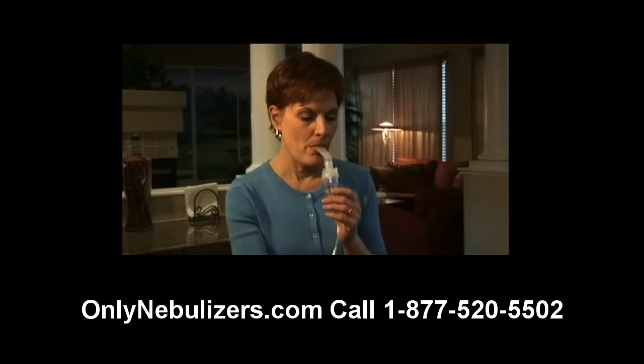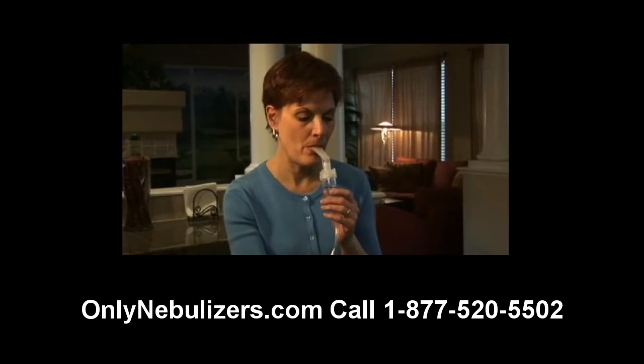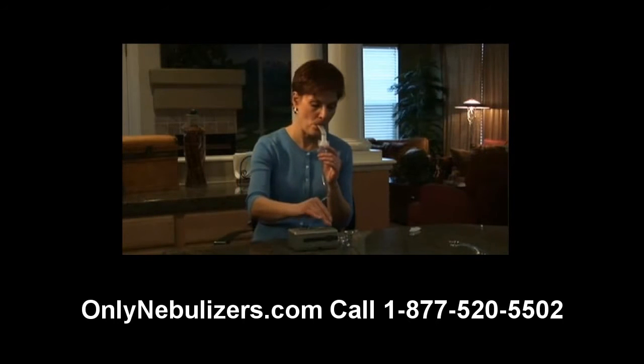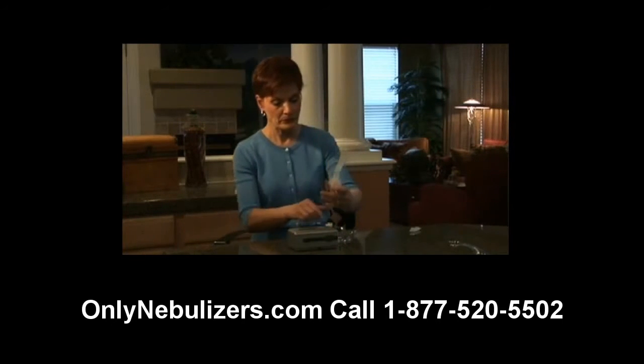You're now ready to begin treatment by turning the compressor's power switch on and placing the mouthpiece between your teeth. With your mouth closed, inhale deeply and slowly through the mouth, then exhale slowly through the mouthpiece. If you need to interrupt treatment, simply turn off the power switch and place your nebulizer into the holder on the traveler.